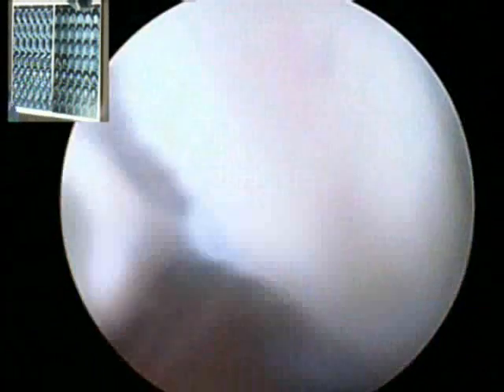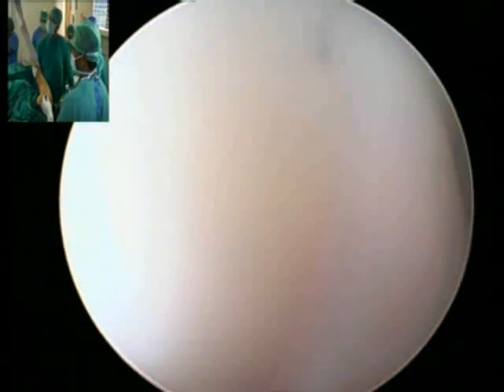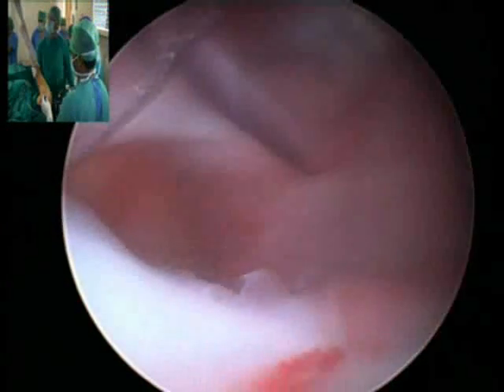Okay, we are back with the water now. Are you getting the inside picture now? Yeah, it's getting clear now. In 2 minutes, I'll tell you if I need more pressure. I'm sorry, my camera picture here is a little bit hazy. I tried very hard to correct it. And he has no SLAP here, which I confirmed.